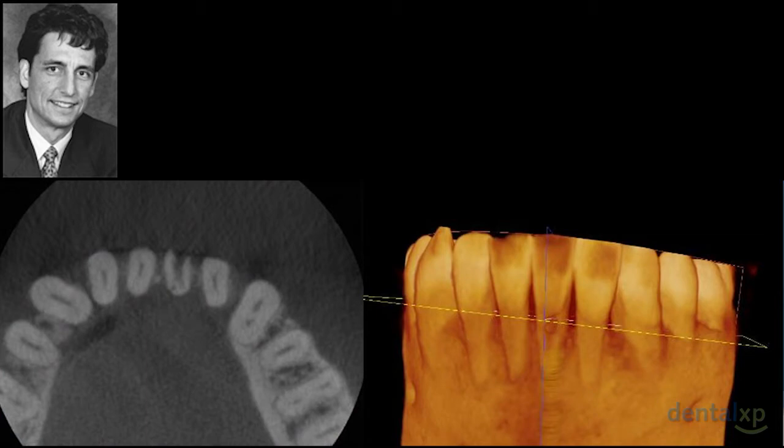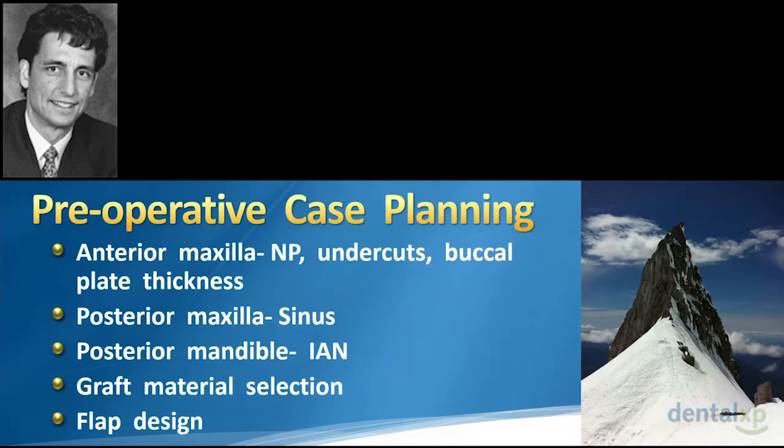Somehow with 3D renderings, these are the most useless for us. We look at the 2-dimensional images for our primary use at the different axial plane or sagittal. But somehow this 3-dimensional rendering is what triggers the patient to really understand, hey, that's me, this is the defect I have. And so it really helps you in getting these patients on board with the treatment and explaining to them why you can or can't do what they want.